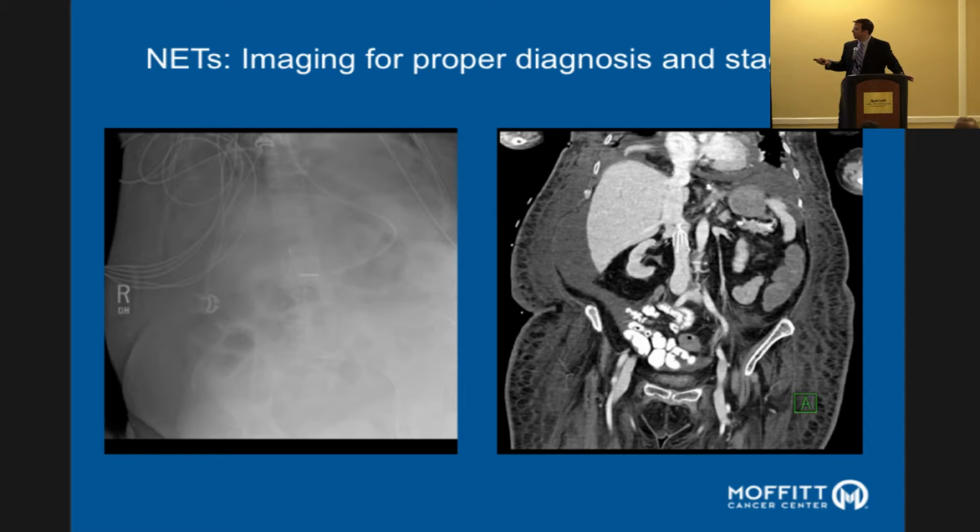And when I talk about more information, here's an example of that. This is a real patient in the hospital, not a neuroendocrine tumor patient, but suspected bowel obstruction. This is a radiograph of their abdomen that was actually obtained. If you're looking at this and you think it doesn't look that good, you're right. But this is what you run into because patients are sick. They can't leave their hospital bed, so you have to get radiographs that are done portably. If the patient is obese, which this patient was somewhat, it can limit what you're looking at.